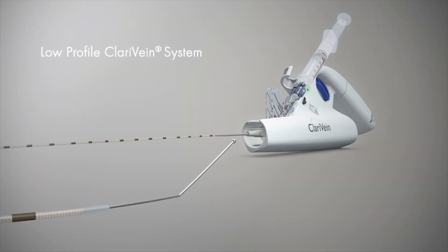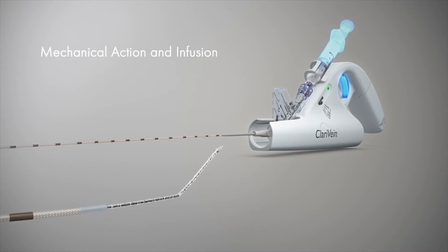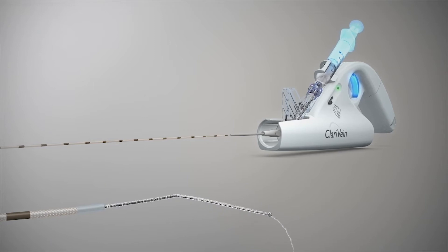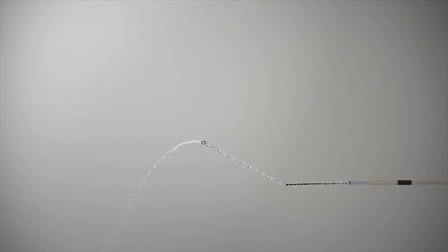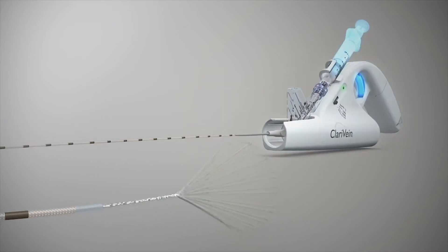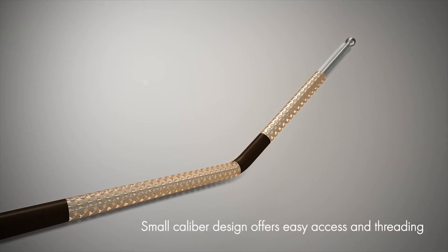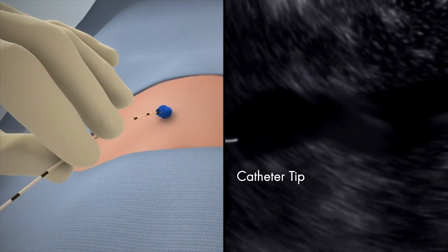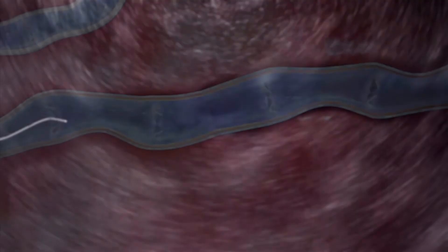The revolutionary low-profile Claravane system combines mechanical action with the infusion of physician-specified fluid. The small caliber design offers easy access and threading, typically deployed through a four or five French microintroducer under ultrasound guidance. The catheter tip shows brightly.